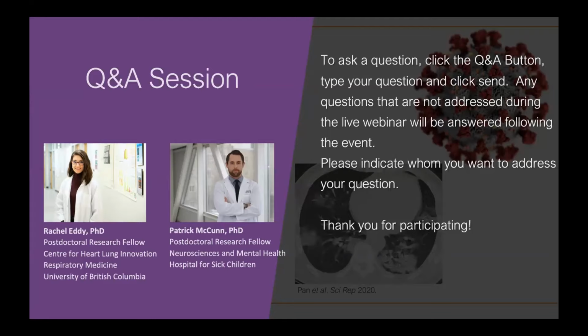I guess to add to that, the MR system Patrick alluded to, basically there's no cryogens or liquids needed to cool them, so you don't have to deal with those fluids. The PET-CT system is also self-contained, so it is shielded on the CT component, so there would be no additional infrastructure needed for that installation. So all of the systems work quite well within a BSL3 environment where space is tight and you don't really want to have to build extra infrastructure to facilitate adding one of those systems to the environment.